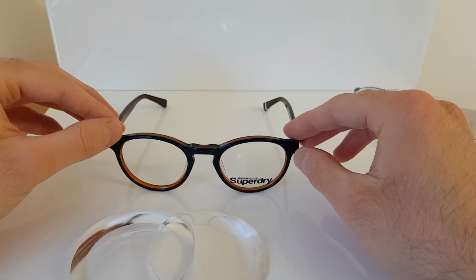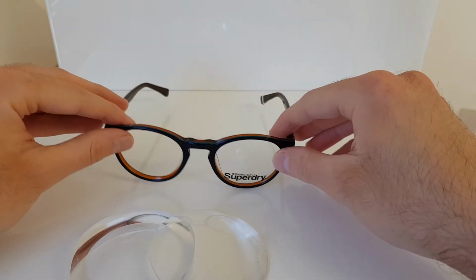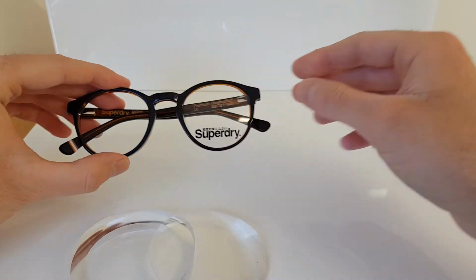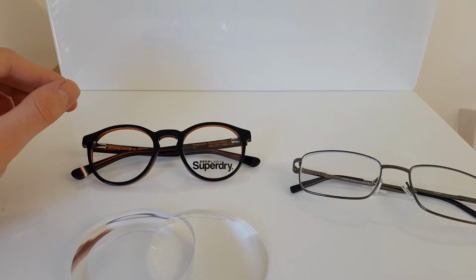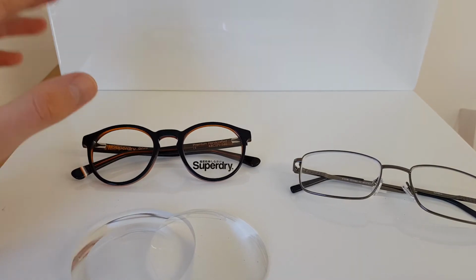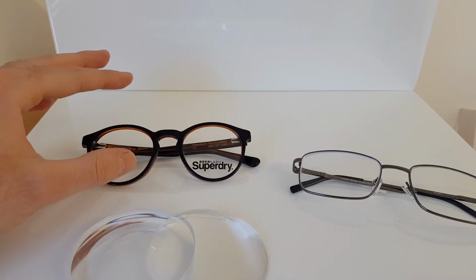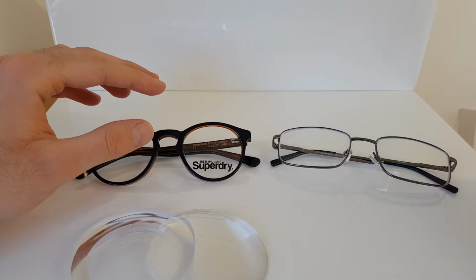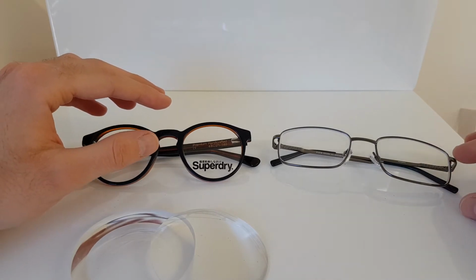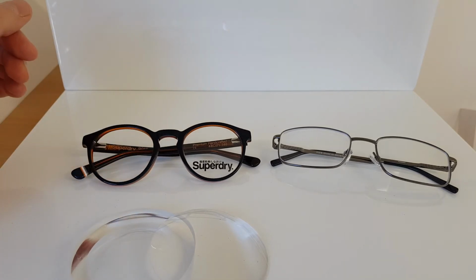So that's something just to think about, and it is more in depth than that, but this is just to give you a general idea of what we look at when we deal with a high prescription, because we've had actually quite a few of them come through over the last few days, to be honest. So just think about the shape of the frame. So a round, smaller eye size is really good. Don't go for anything too square, too oversized, because that's going to increase the weight and the thickness of the frame. And also look at having a thinner lens added into the frame as well.